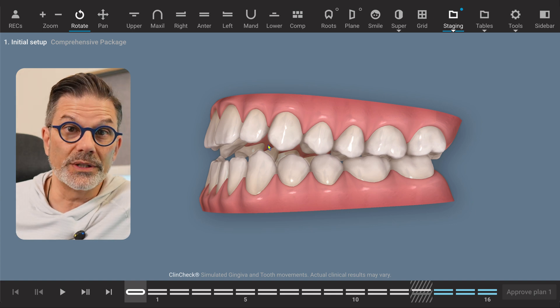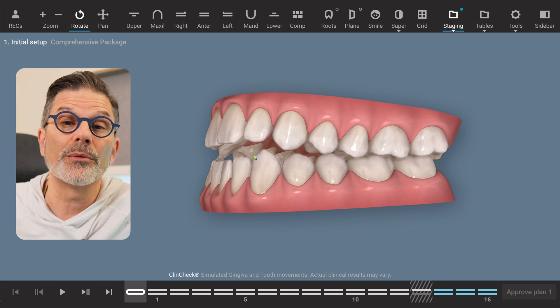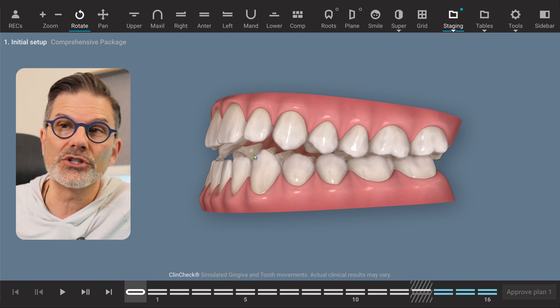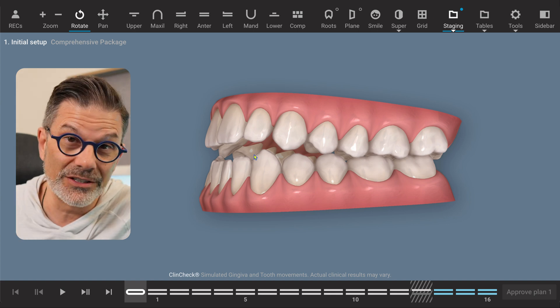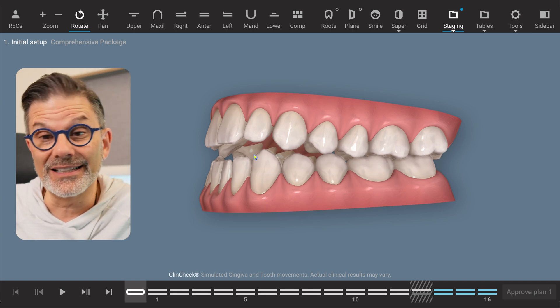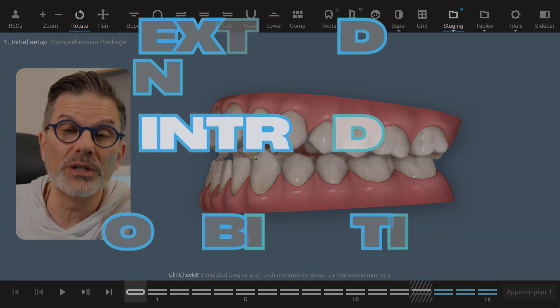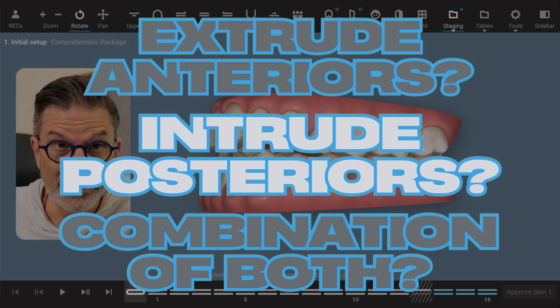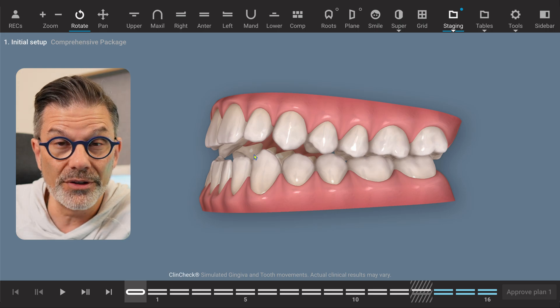Let's say the patient doesn't want any surgery and wants to be treated with clear aligners. So knowing we're going to use clear aligners, we're going to move the teeth. In a case like this, we have to figure out how we will treatment plan the case. Will we extrude the anterior teeth? Will we intrude the posterior teeth? Will we do a combination of both? This is treatment planning the case — thinking about what is best for this patient.